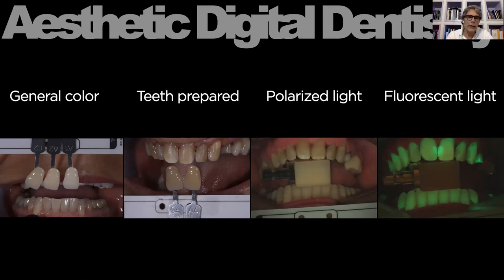activating the true light filter with which we can remove all the flashes of the light onto the buccal surfaces of the natural teeth prepared and not prepared, and positioning a CAD/CAM block in the middle between the tooth prepared and not prepared, you can better study the chroma that you have to choose in your library. So I took the last picture, activating the fluorescent light that helped me to compare the basal fluorescence of the different CAD/CAM blocks of the different materials, comparing with the teeth prepared and not prepared. Following this work procedure, I am able to choose the best material for the case that I am treating.